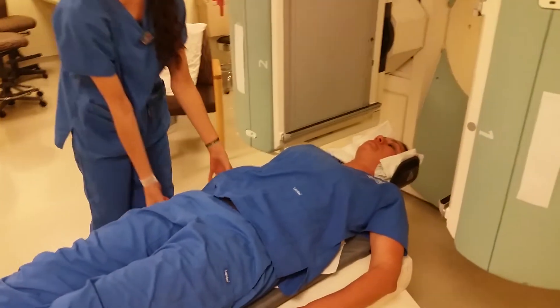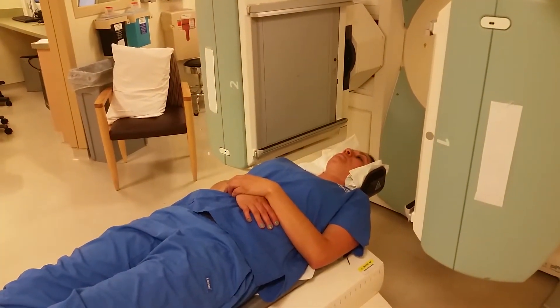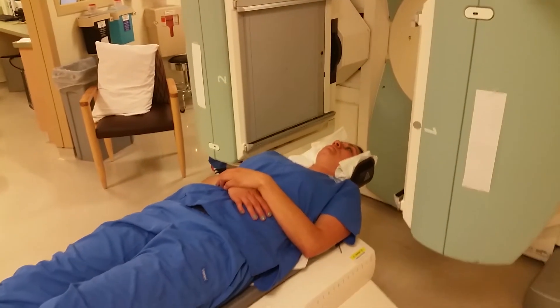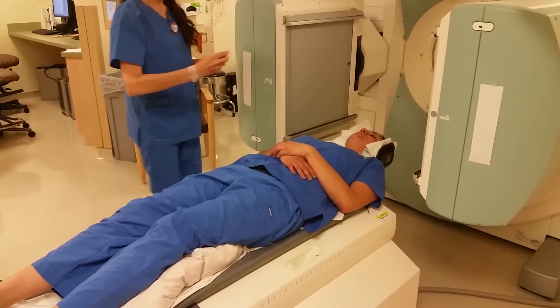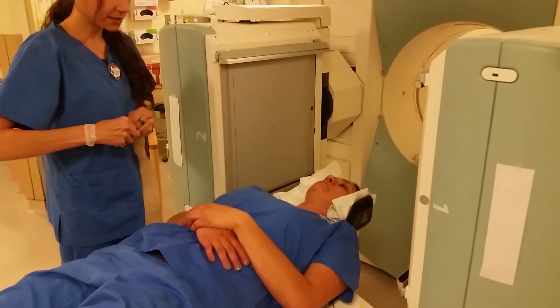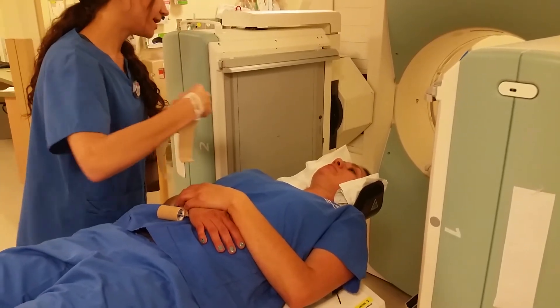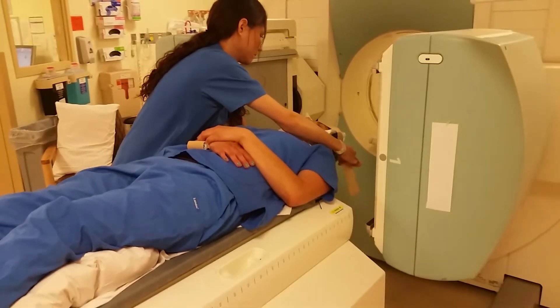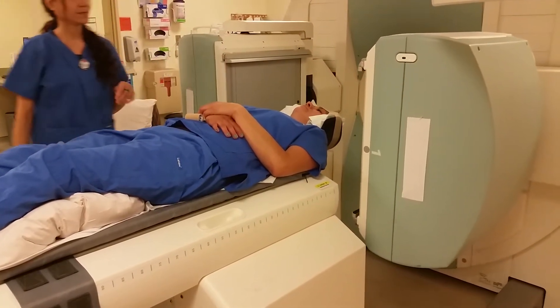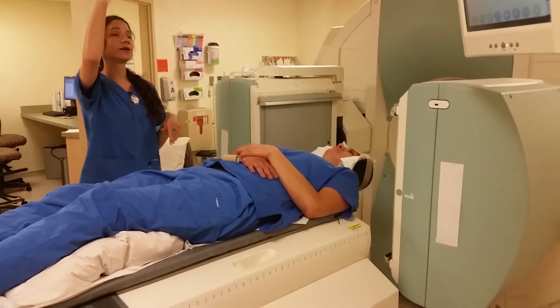Can you rest your arms right across your belly for me? There you go. Do you want a blanket? I'm going to raise the table a little bit right now, Jessica. During this scan, you can just breathe normally — you don't have to hold your breath. Take a little nap if you want. And then I have this co-band; I'm just going to rest it right across your forehead just to make sure your head stays nice and steady.